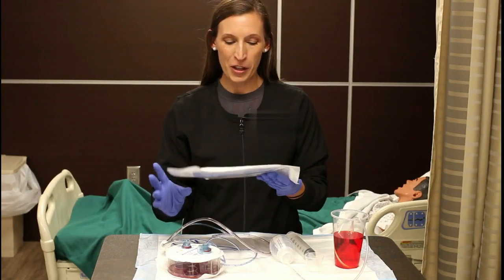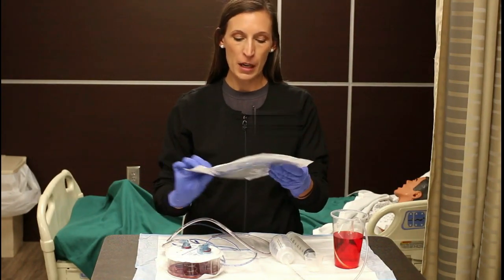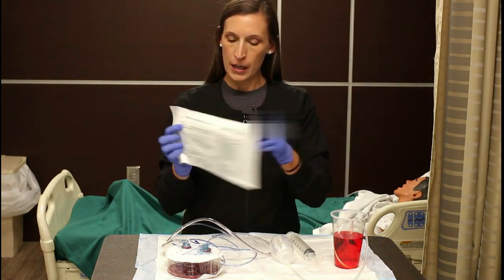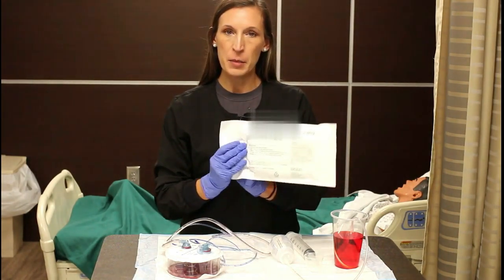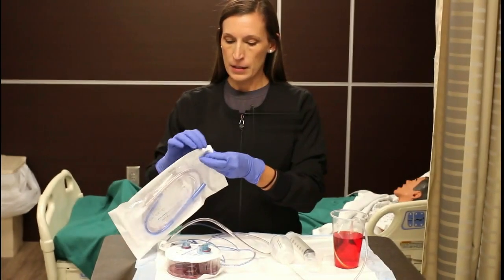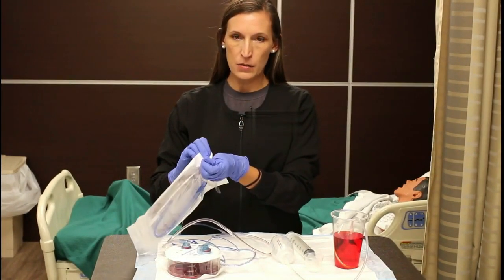Let's look at tubes and drains. The first one is the Salem sump tube. This one is a 16 French. With a French size, the bigger the number, the bigger the tube. 16 is pretty average size for an adult.